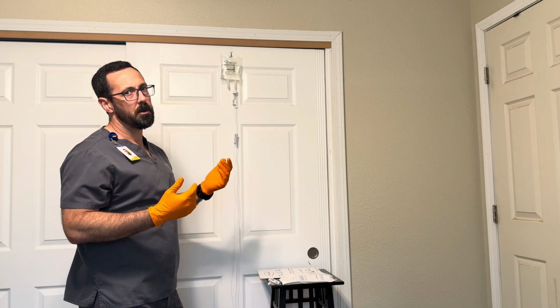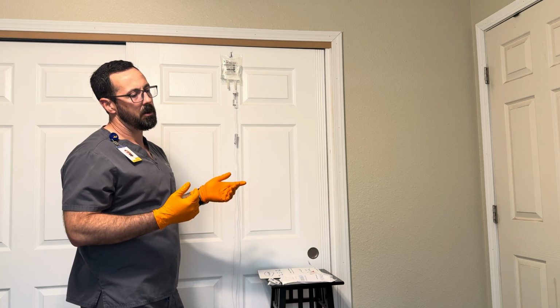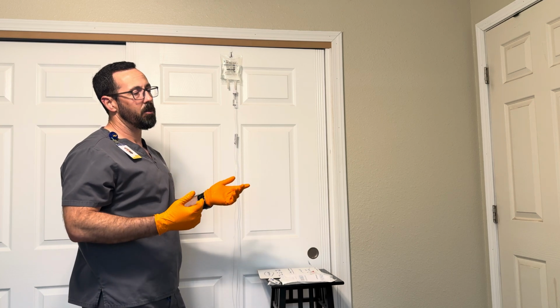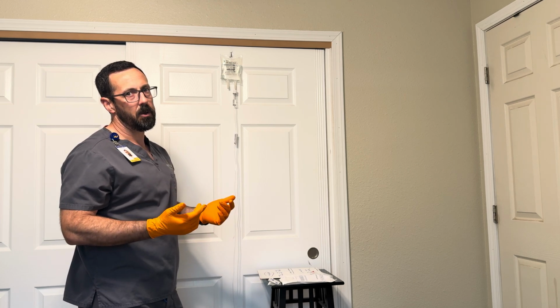So I'll have a pretty good visualization as soon as I start, and then once I think I'm in the right area, then I'll start my full minute of counting to verify that I'm at the correct drop rate.